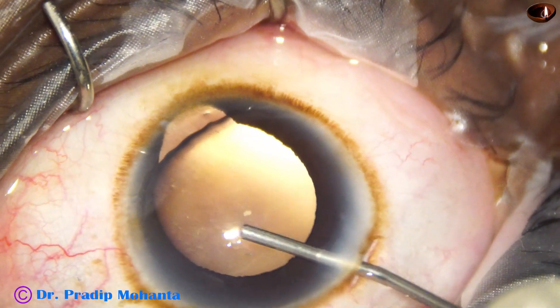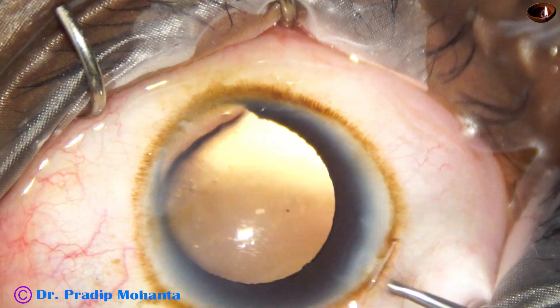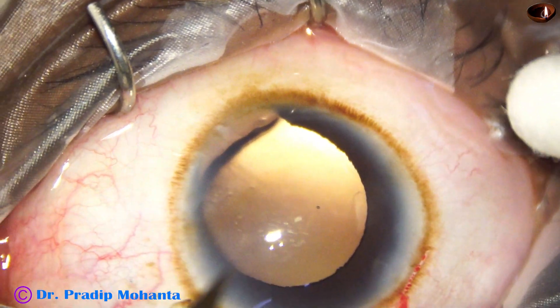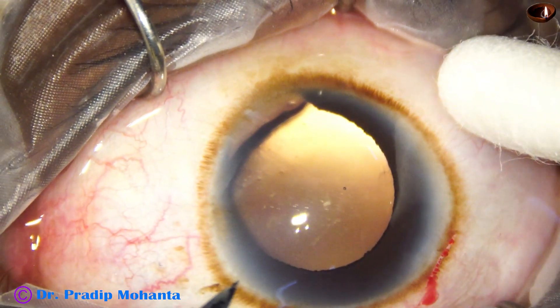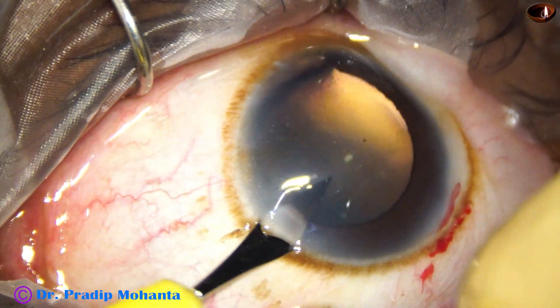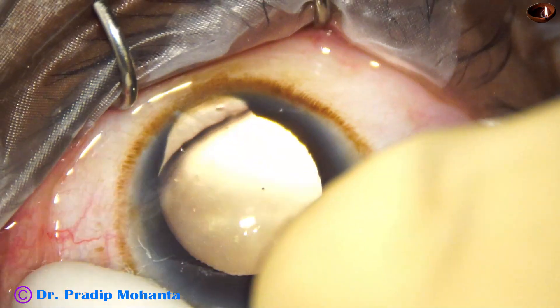The patient is above 45 years of age with very poor vision. So we planned phacoemulsification with intraocular lens implantation.